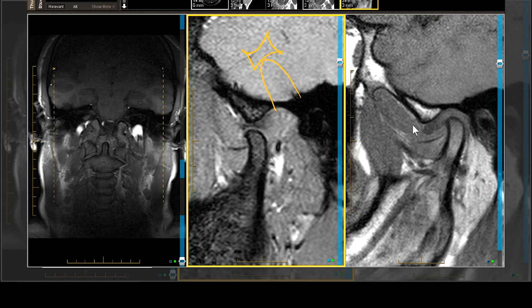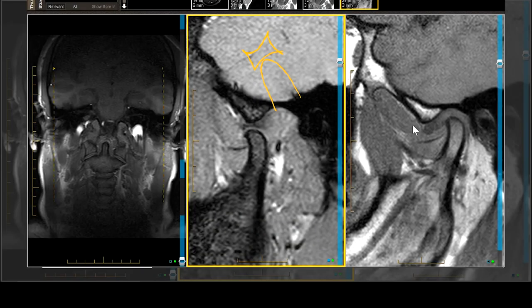There's also a little bit of sideways displacement laterally of the meniscus. You can have sideways displacement medially, sideways displacement laterally, or rotational displacement which is anteromedial or anterolateral. This one is rotational displacement — anterolateral.